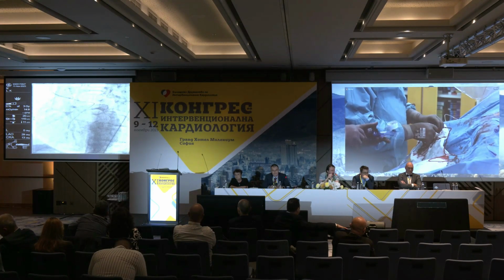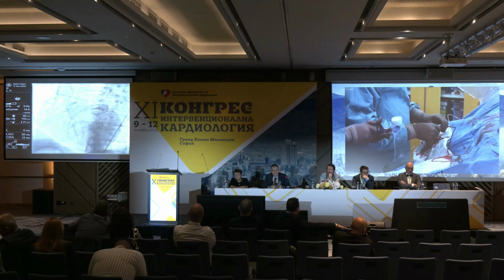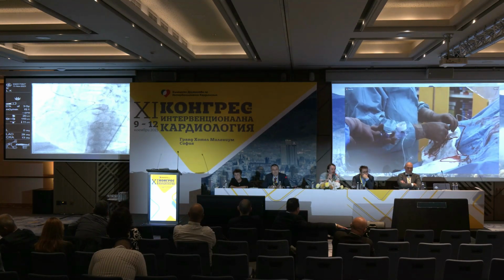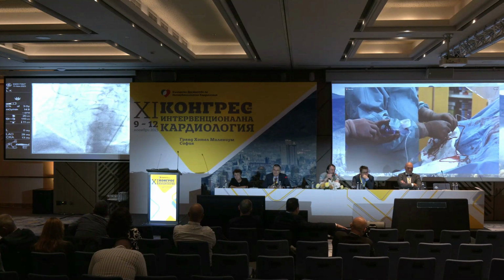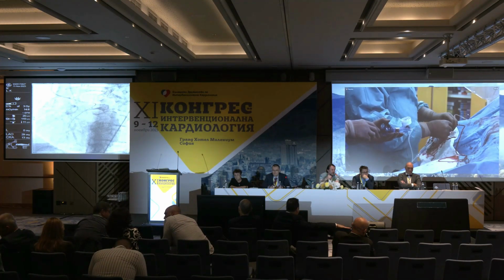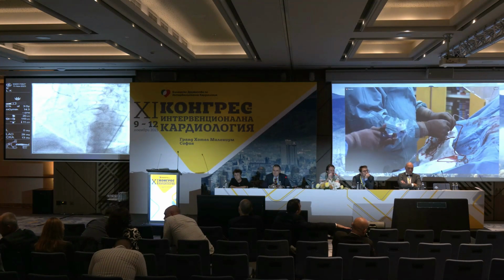2,500 times. Yeah. 16. Yeah. Down. And then we learned, be careful at every step. Yes, of course. Because we know what's happening in the next step, so we have to prevent it before we go on. Okay, down.